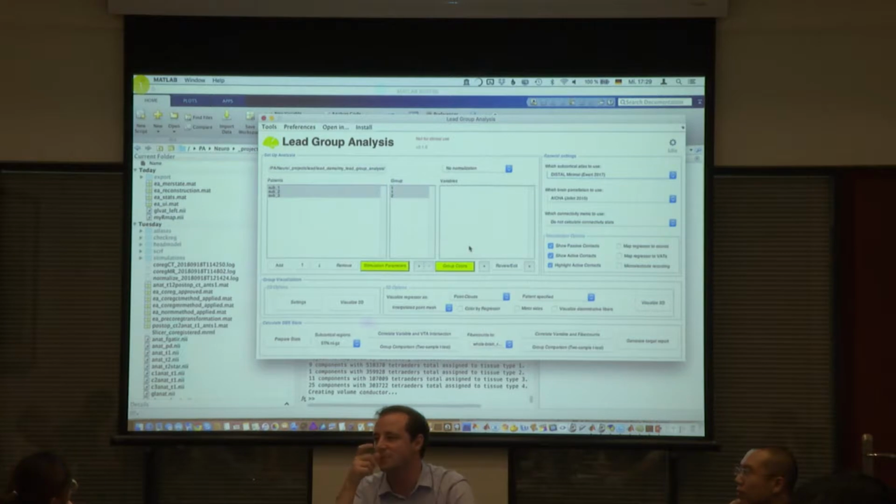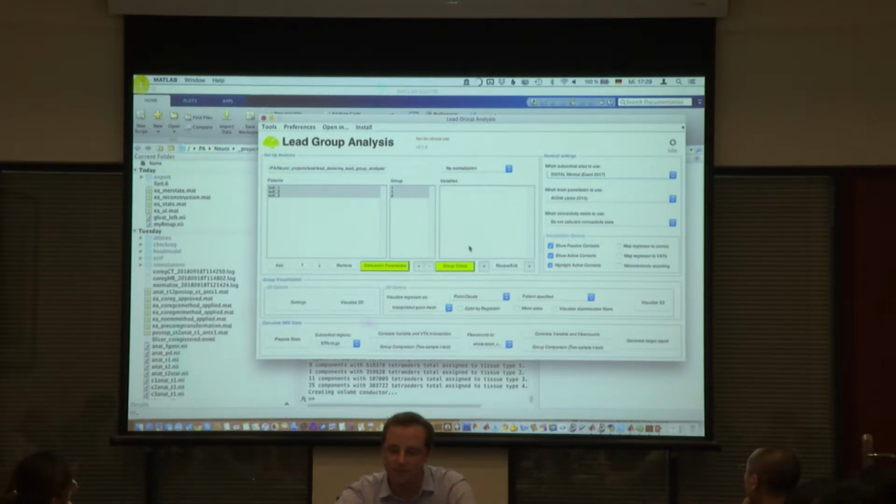You mean in terms of monopolar reviews and so on? Or bipolar configuration? Not really. I know that Till Dembeck, who does a lot on monopolar reviews, has good scripts. So you could shoot him an email, because he has these scripts where he has, I think, 100 simulation parameters in each patient and then does things with it. But in here it's not really possible.